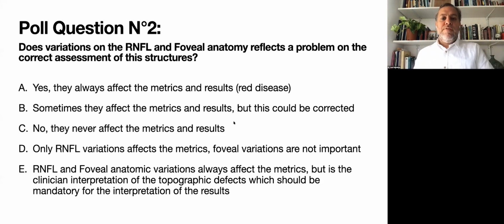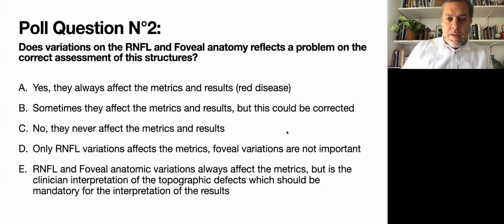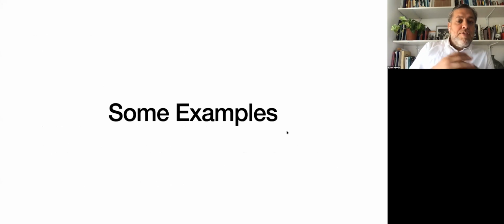Okay, so we have the correct answer, 74%. The clinician should take the last word interpreting the results. Let's see some examples of this topographic analysis.